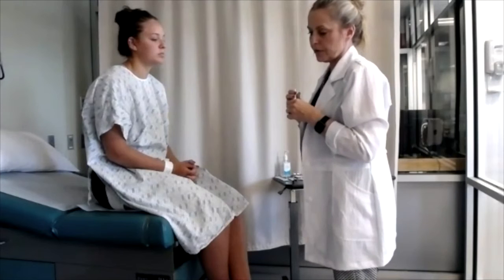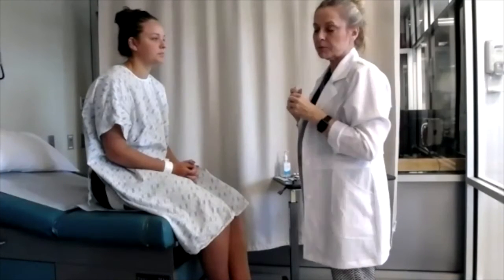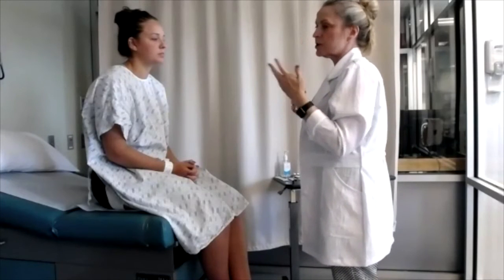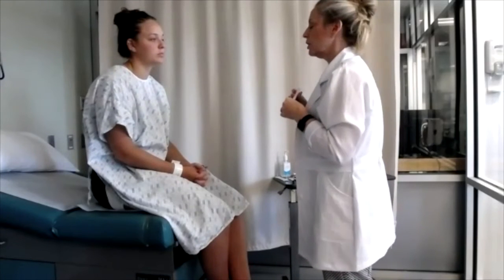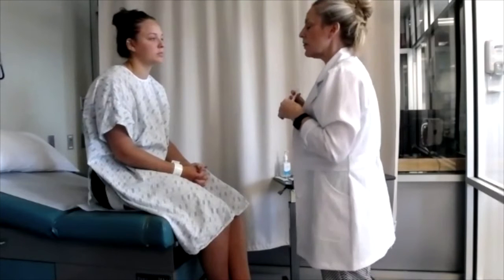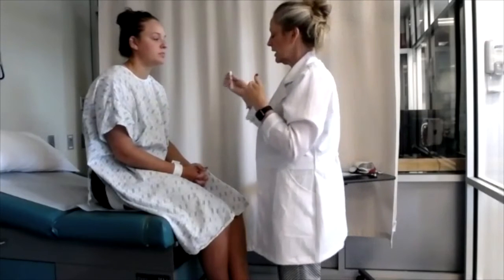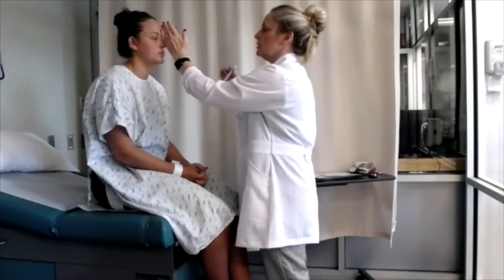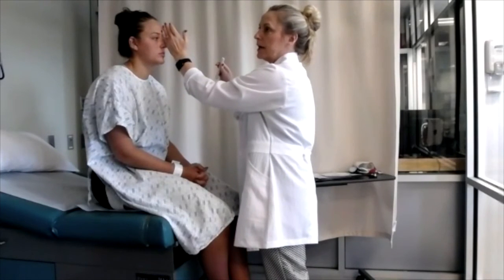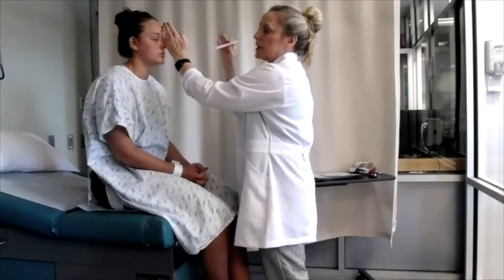Another test for cranial nerve 3, which is your oculomotor cranial nerve, is pupillary response to light and accommodation. To do this, you want to make sure your lights are out because you're going to be watching the response to light with her pupil, so you need it to be darker than you normally would. So you turn the lights out if you haven't already done that. And as I have her looking straight ahead to me, I have my pen light in hand. I want to put a bridge in the middle, and that way it's not interfering with that eye, and I'm able to better assess. So I put my light out here, I come in from the side.